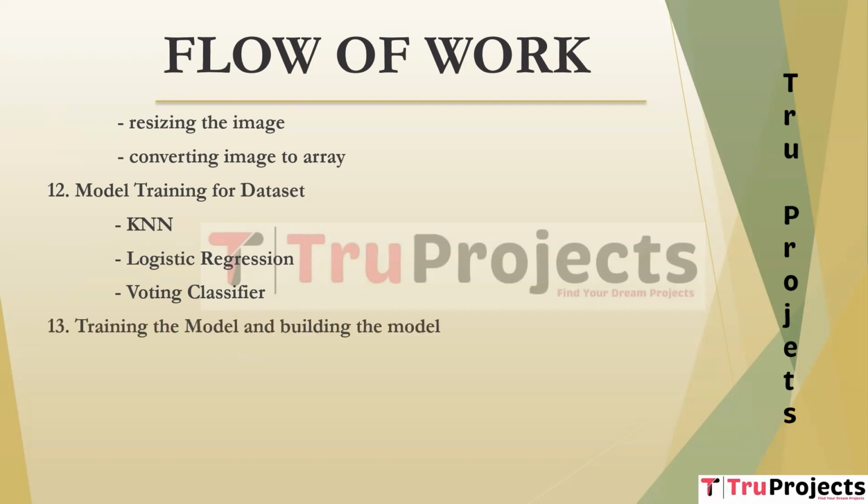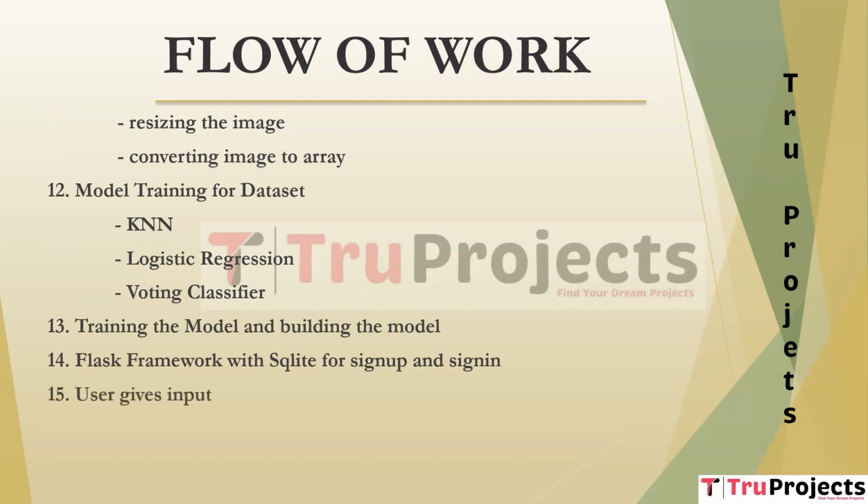Training the model and building the model. This phase encompasses training and building the machine learning models for classification. Flask framework with SQLite for sign-up and sign-in. In this module, the Flask web framework is employed along with SQLite for creating user authentication features including sign-up and sign-in functionalities. User gives input. This step involves the user providing input or uploading images for nodule diagnosis.